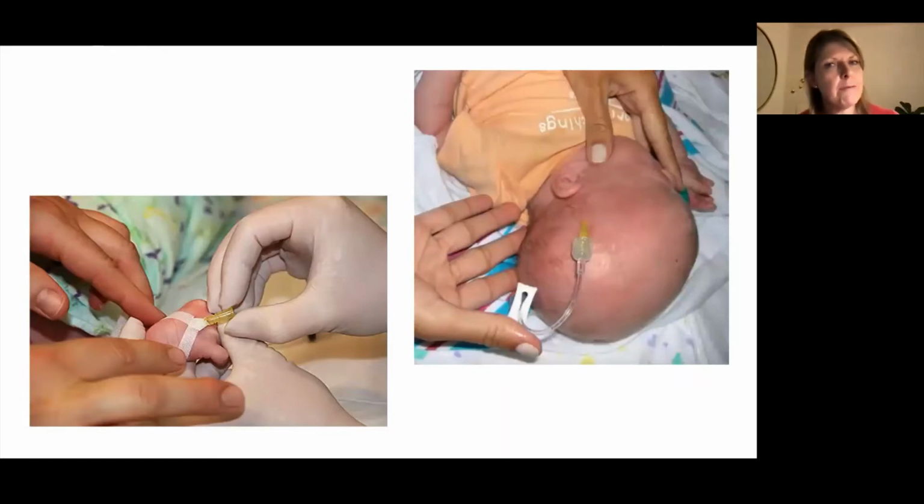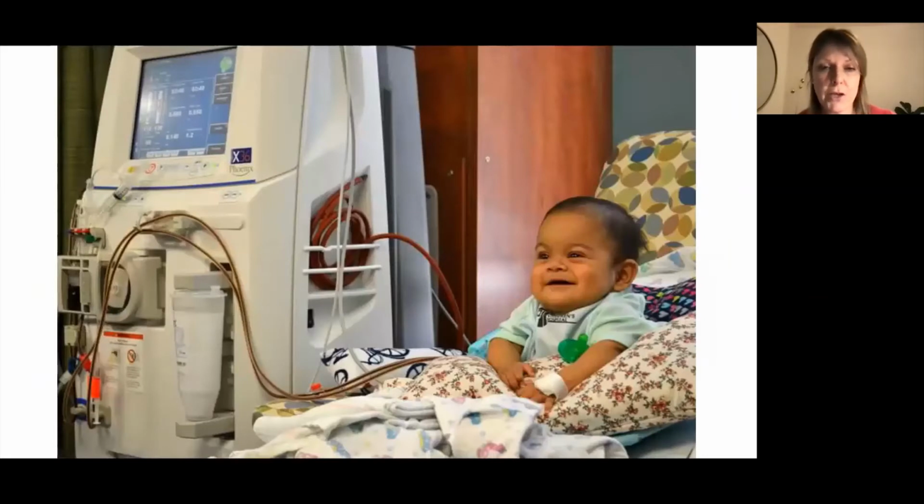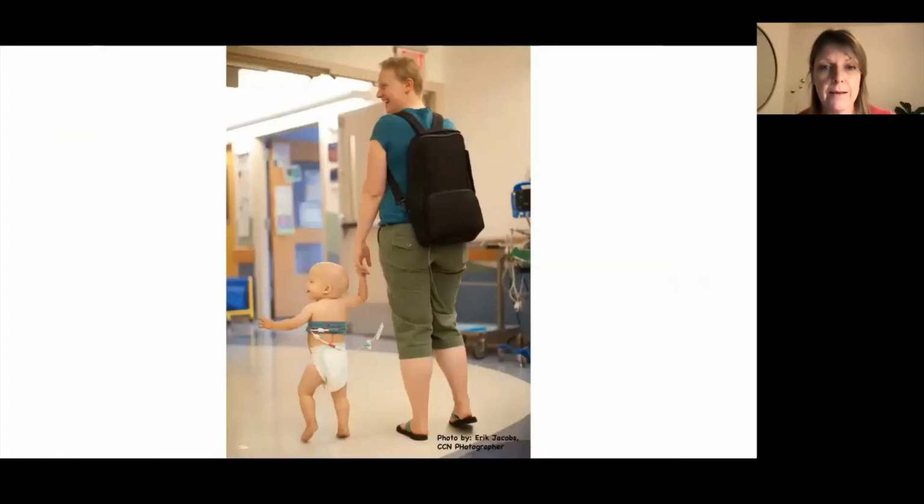Let's start at some of that supposedly very simple supportive stuff. These are pictures that show the dilemmas and the traumas of peripheral venous access in children. The child on the right has totally run out of peripheral veins and is having to have a scalp vein used for his cannula here. But actually, this is not what we should be seeing. And if we're offering a good line service in a paediatric hospital, we can ensure that children like this chap here, who needs a reliable line for his hemodialysis, and this patient who needs a nice, easy line for access for chemotherapy, can get those lines, and the children and the families who are going through all this other stuff and have got plenty of other things to focus on can get on with it and focus on those other things and not be worried about the endless cannulations, which for some children can just become the complete focus of their admission and scar them physically as well as emotionally for life.